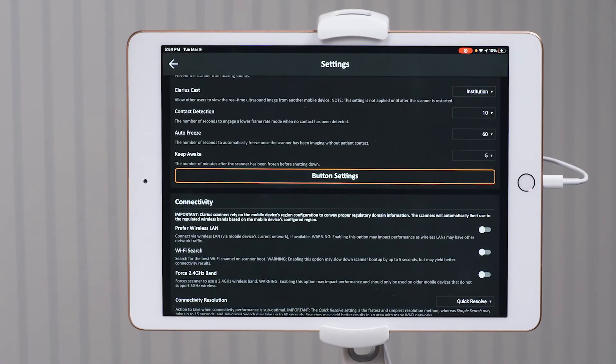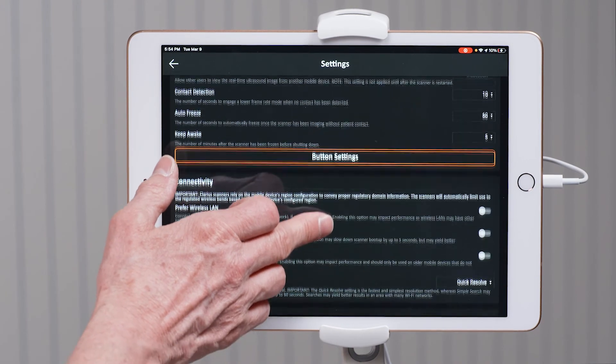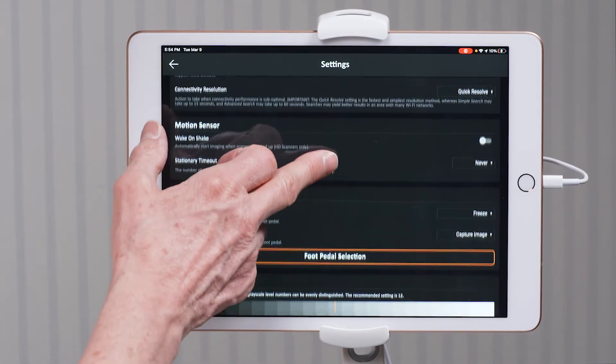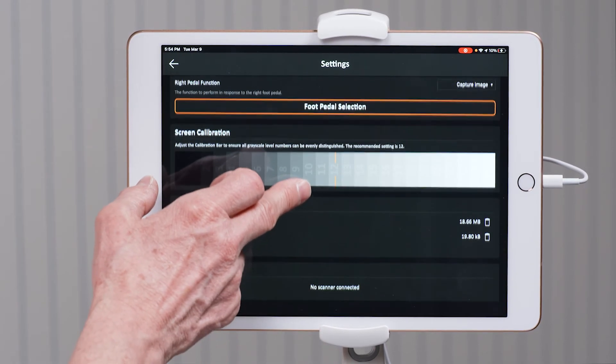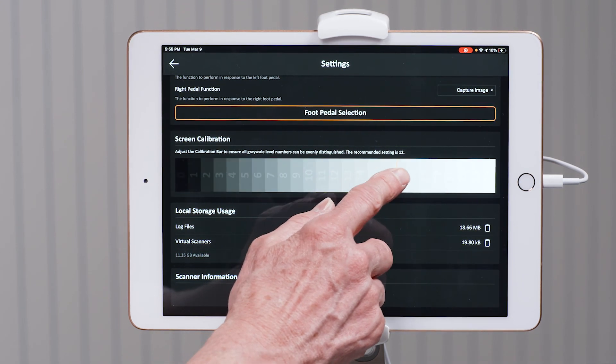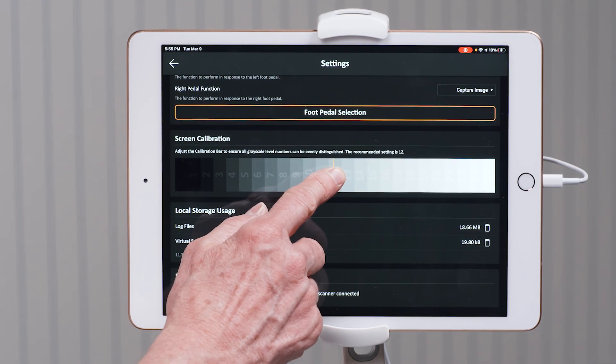Now I'm going to arrow back, and as we scroll down further you can see the connectivity. Because Clarius uses direct Wi-Fi, you will not need to use the Wi-Fi in your office, so all of mine are turned off. The last thing I like to check is the screen calibration. It says that a setting of 12 is recommended. If yours is not on 12, take your finger, touch the gray bar, and move the orange indicator to 12. That will give you the best contrast resolution when you're scanning a patient. If you need more information about the settings, go to the Clarius support page at support.clarius.com.